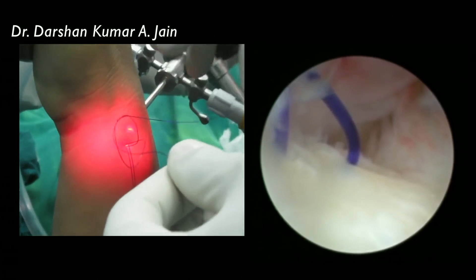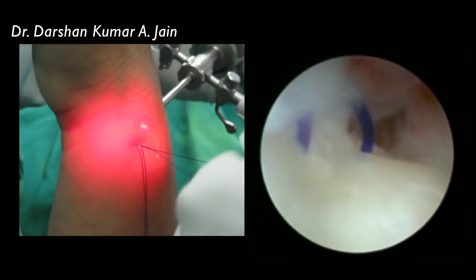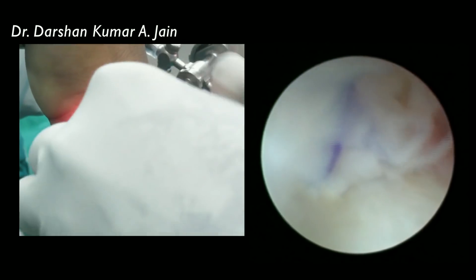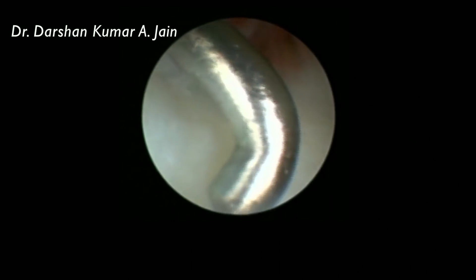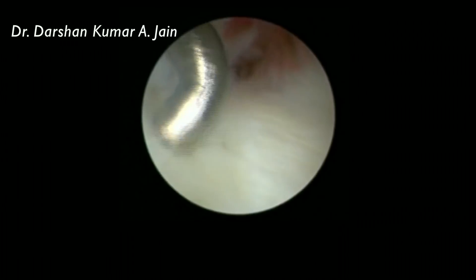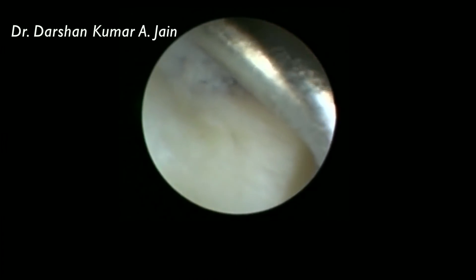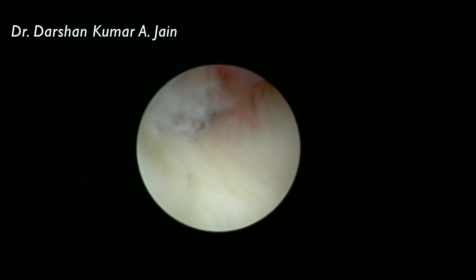The capsule is approximated to the TFCC as you tighten the PDS. The trampoline effect is then checked, and there is a good, taut TFCC at the capsule after the repair. Following this, the wrist is immobilized for 4 weeks in full supination, and mobilization is started after a month.